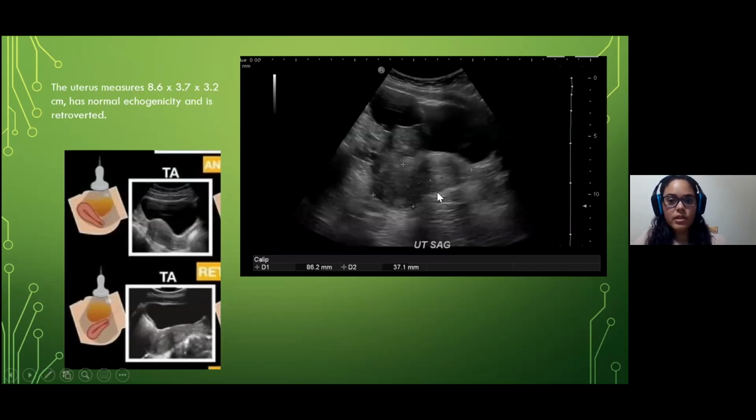So starting with the uterus, we did a pelvic ultrasound on her, as I said, and this is the uterus. One of the things, it was retroverted. I find that interesting. Of course, I'm learning. So I found a Google picture that shows how the anteverted uterus, the most common finding, has the fundus pointing to the bladder. And the retroverted is pointing away from the bladder. So hers was pointing away. So, a retroverted uterus, but it was normal in size, nothing major there.